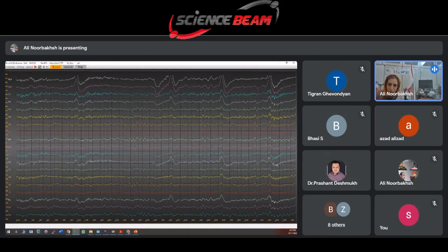Okay, but for brain mapping, we just need 2 minutes. We record 4 minutes because maybe we have artifacts. But now I don't have any artifact, so I record just 2 minutes.